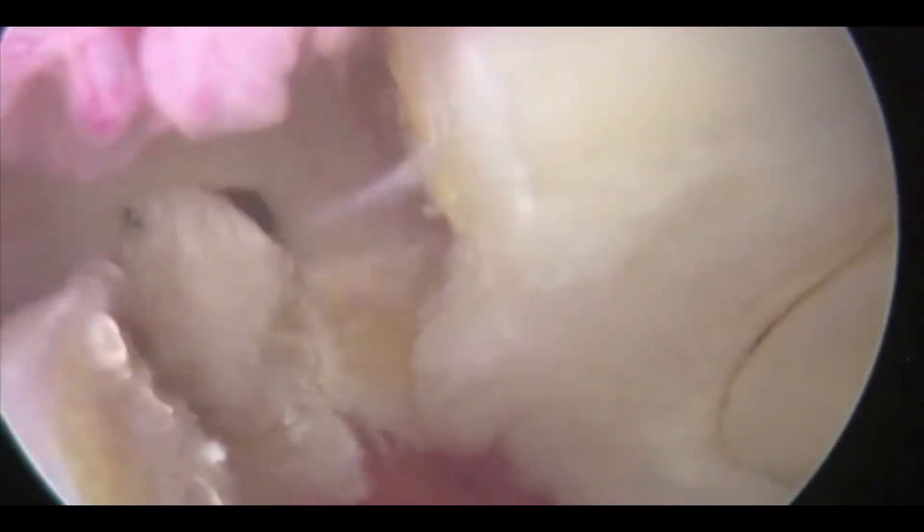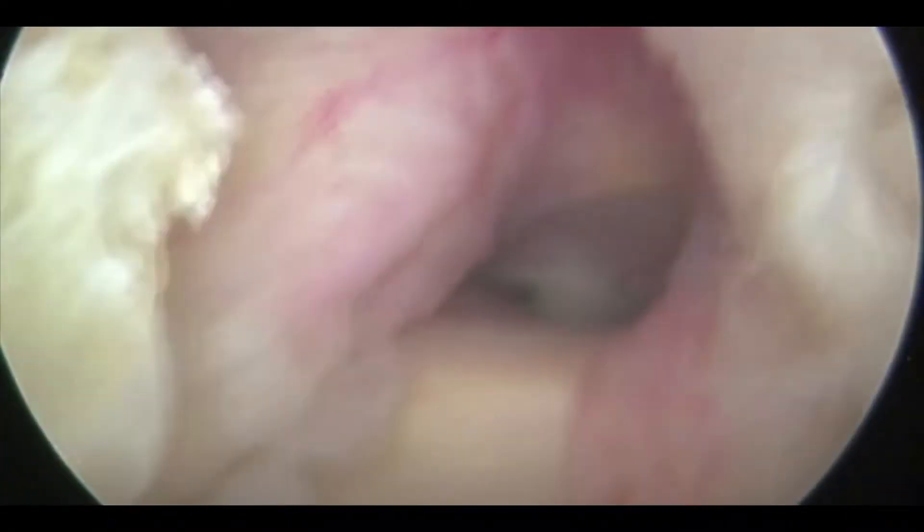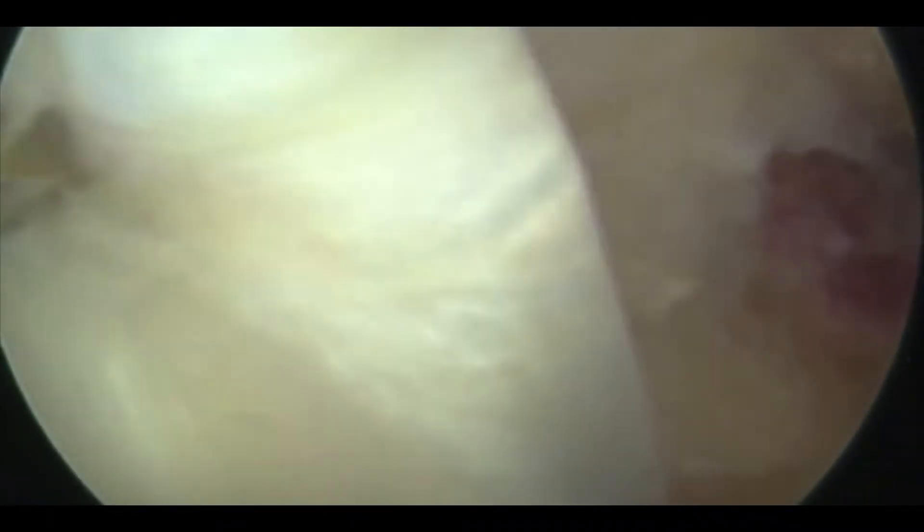We're in the joint. We've done the tenotomy — you can see the tendon didn't retract. The tendon is still in position, so we're going to go back to our tenodesis site.